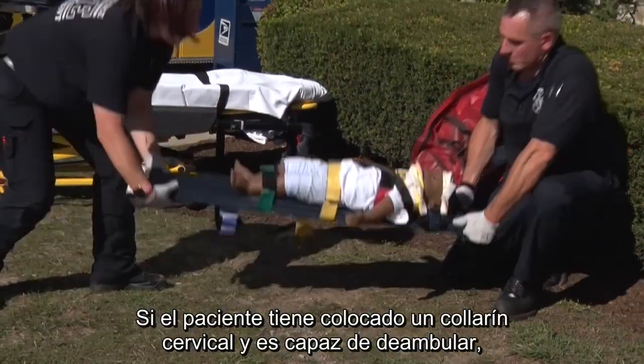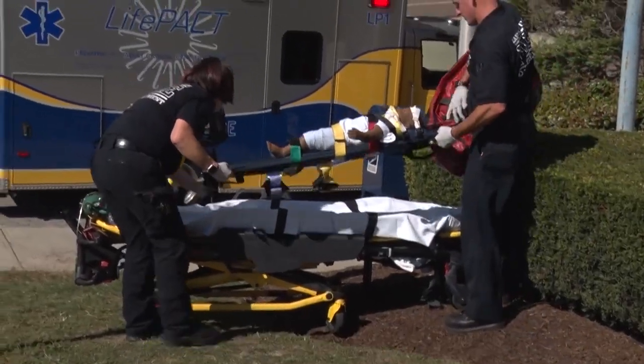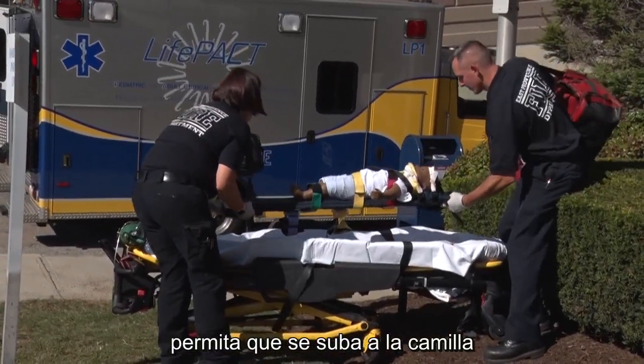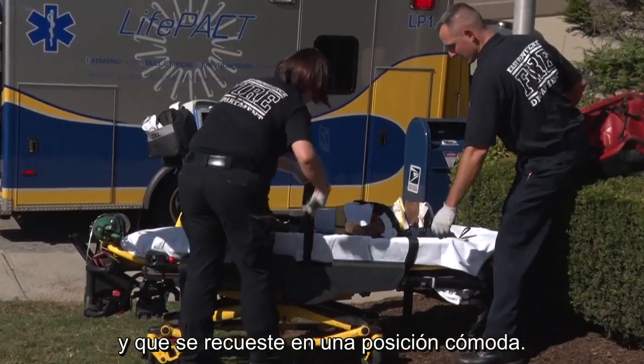If the patient has a cervical collar applied and is able to ambulate, allow him or her to assist with getting to the stretcher and lying flat in a position of comfort.